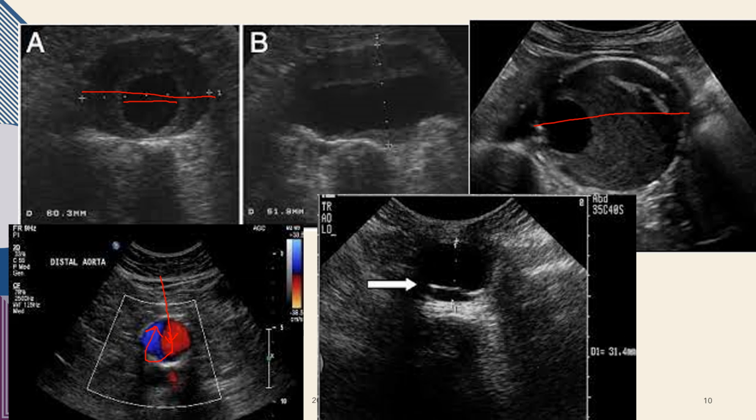So you'd want to follow up an image like this if you didn't see it in long, and you want to take your color flow off. You want to really play with your 2D gain and identify: is there a dissection, or is this just an aneurysm?